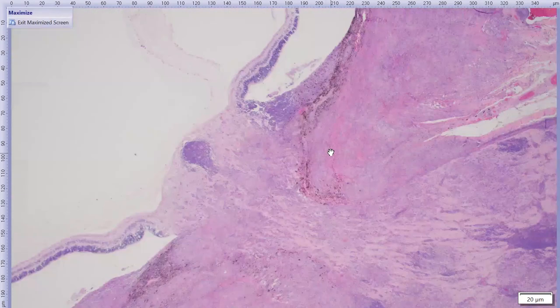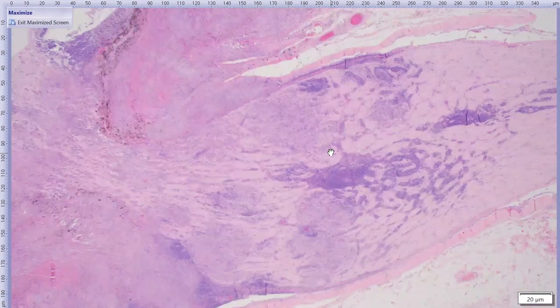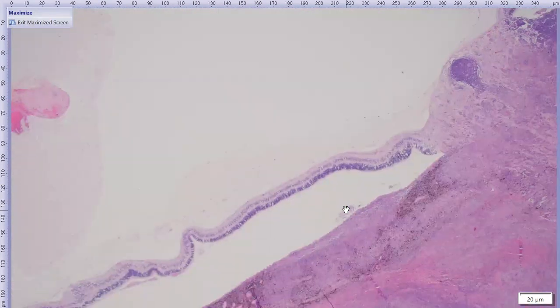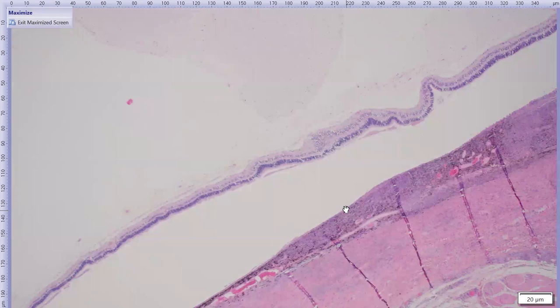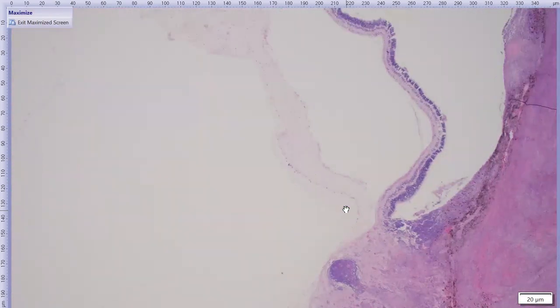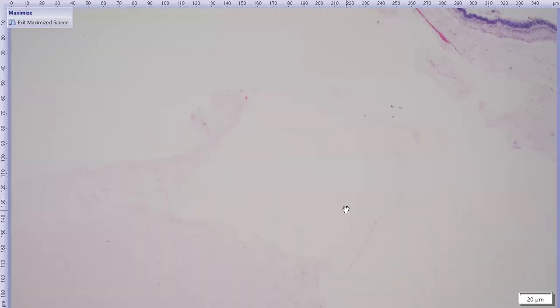And then when we get back to the optic nerve, you can see how severely affected the optic nerve is. These are the more histiocytic populations, and these are definitely going to be more of the dense lymphocytic foci. The retina is not surprisingly detached, probably because the RPE is not very healthy anymore because of the inflammation. So the other eye was surprisingly symmetrical to this. It was slightly less affected.